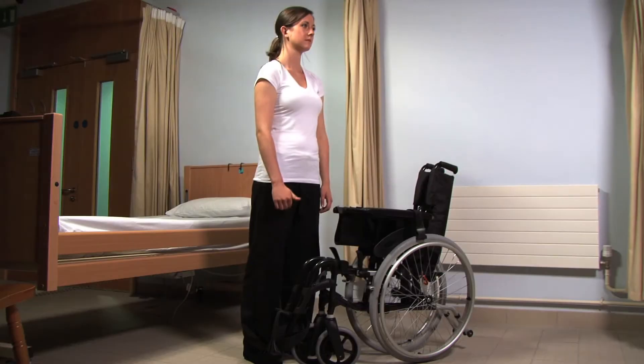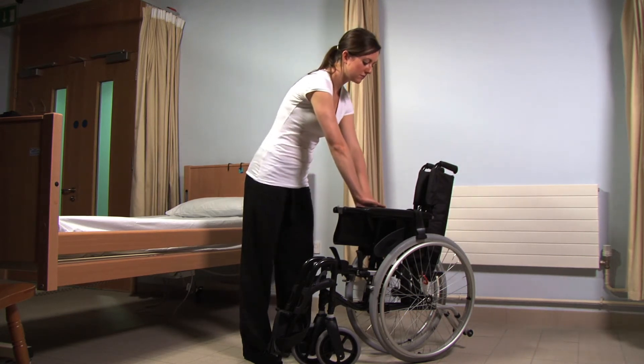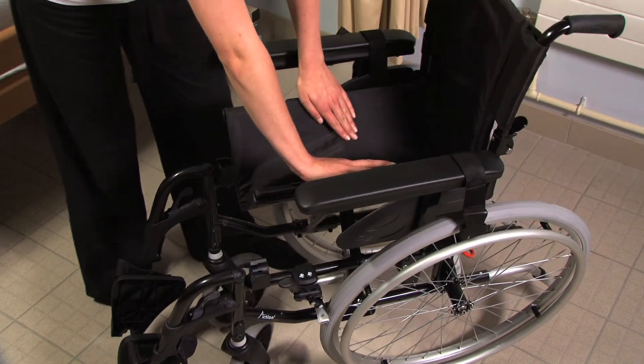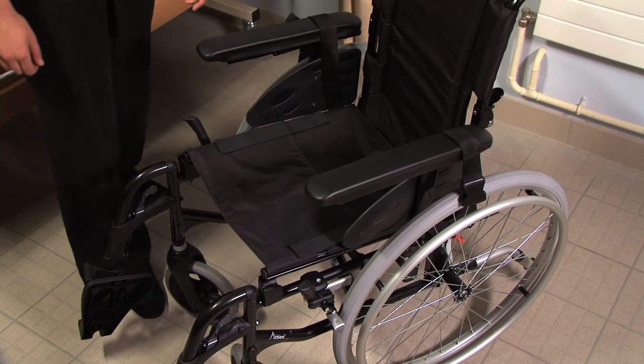A wheelchair is usually folded for storage. To prepare the chair for use, the caregiver unfolds it by placing their hands flat on each side of the seat and pushing down firmly until the seat of the chair is completely flat.